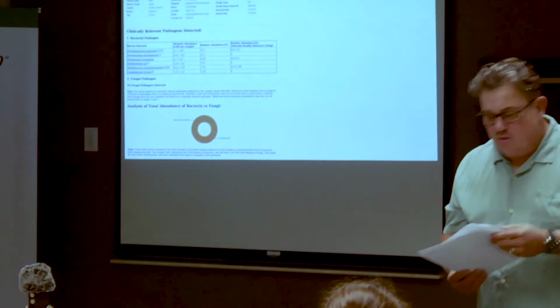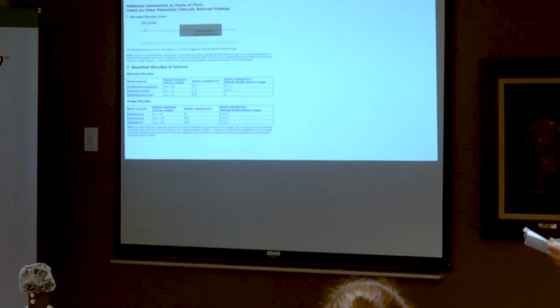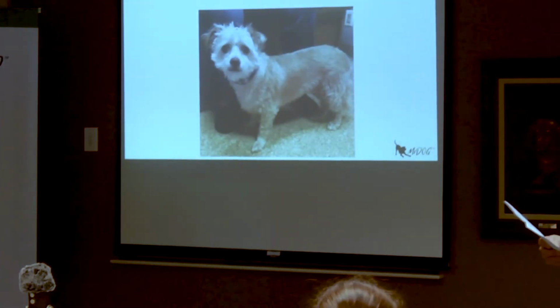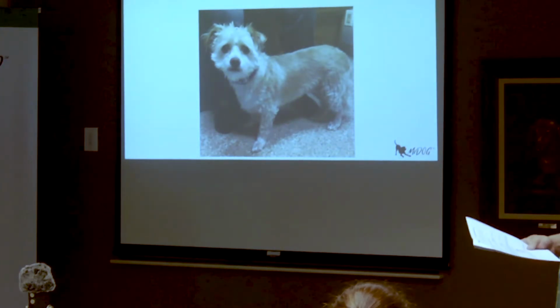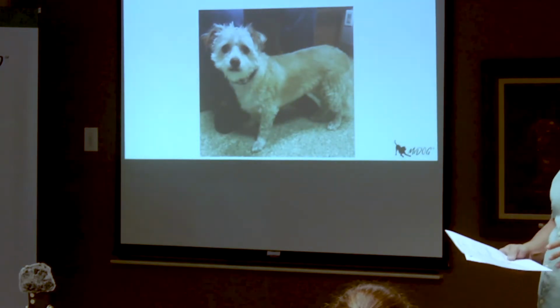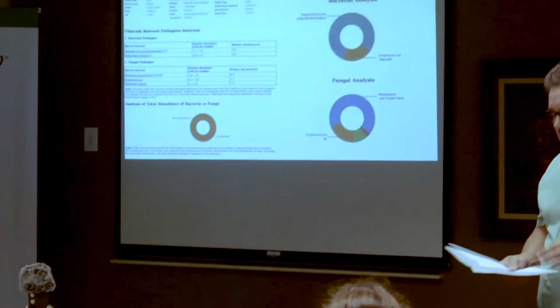So on the report you have in front of you for Daisy, I'll go into more detail now. Daisy is a dog that I've been seeing for probably 10 years. Over the last about 4 years, she's had these chronic UTIs. When she had a UTI, she may or may not have been able to culture it because of finances. If I did culture it, it came back as a staph.